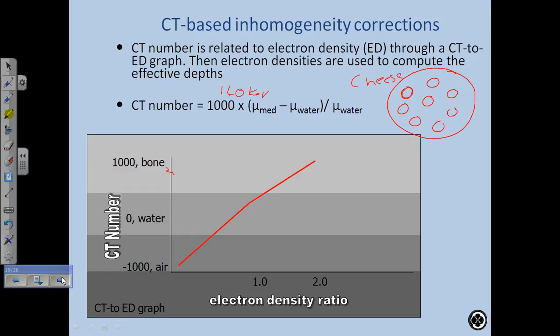So, can you plan off a low contrast CT scan and then apply this? Or maybe what you could do is get a low energy CT scan and a high energy scan, fuse them, and use the high energy one to do the calculations, and use the low energy one to do the contours. Anyway, Don, think of, if you remember those questions. Yeah, I think you're asking Brian about it.